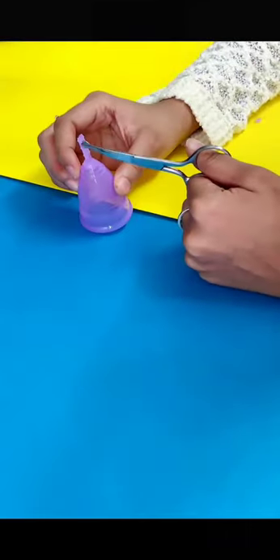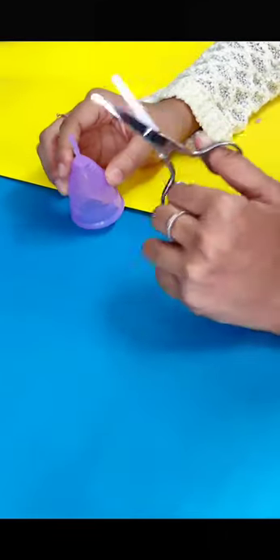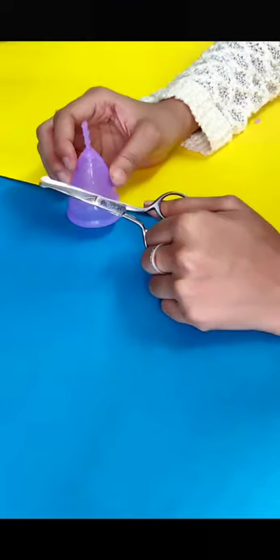You can also cut the other two markings depending upon your cervix height. If you want, you can also cut the entire stem.